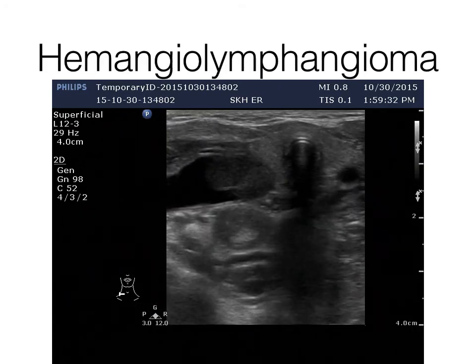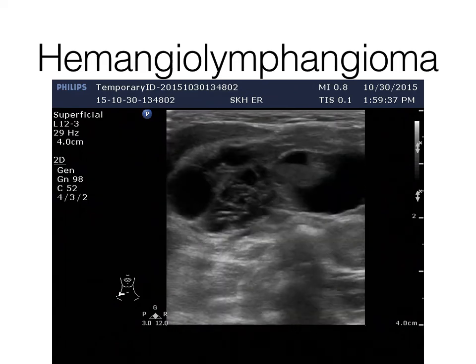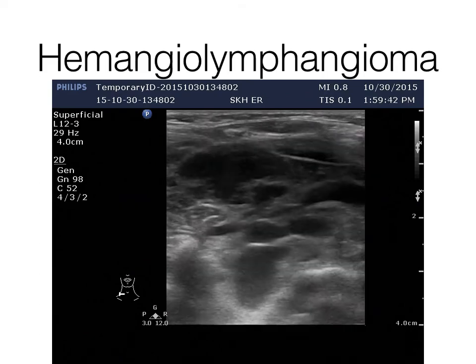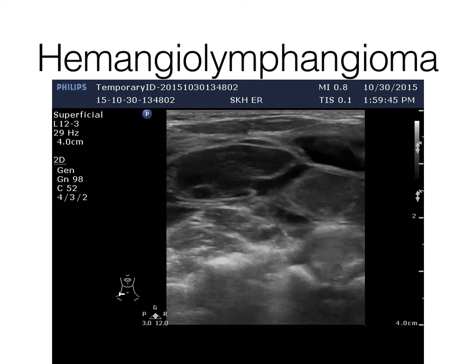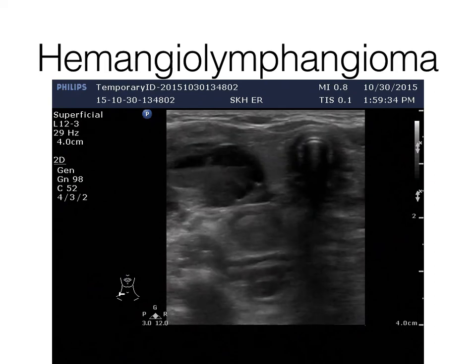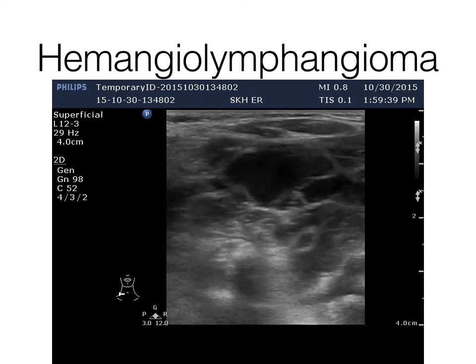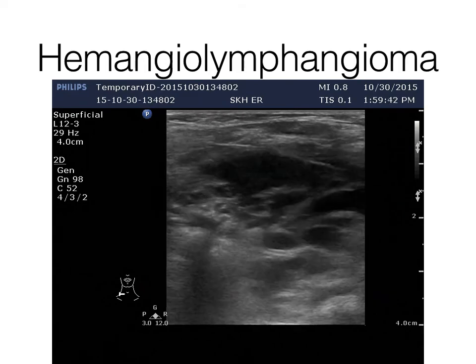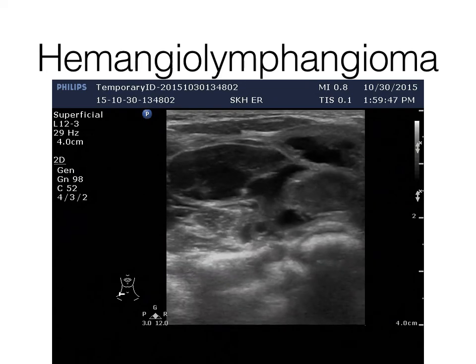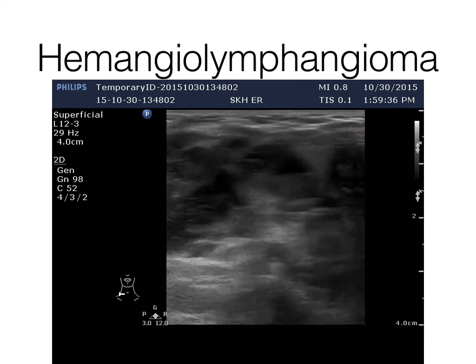What is the problem of this patient, this girl? After we sedated, because we intubated, we feel safe to give the sedation and muscle relaxant. Then, what is the problem? So we need to find out. This is the problem. Cystic component and some echogenic component. The vessel is no problem because we can demonstrate the vessel and use the Doppler function. I'm not showing the video clips here. So the vessel structure is normal.